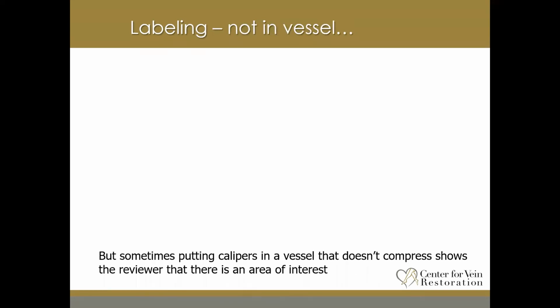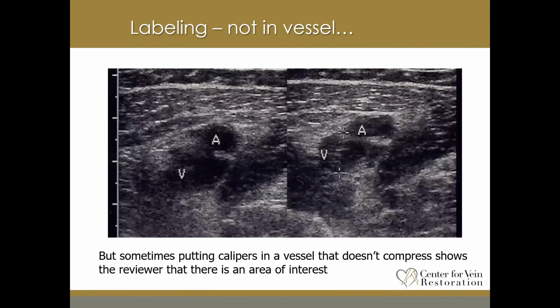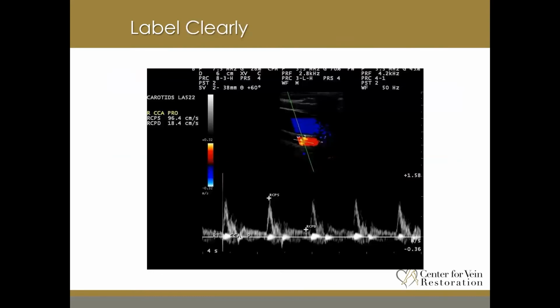One critical thing, especially for physicians reading these exams, is the labeling and the position of that labeling. Putting the labels in places where it covers the image is not optimal because it can distort those findings that are trying to be demonstrated and seen by the reading physician.